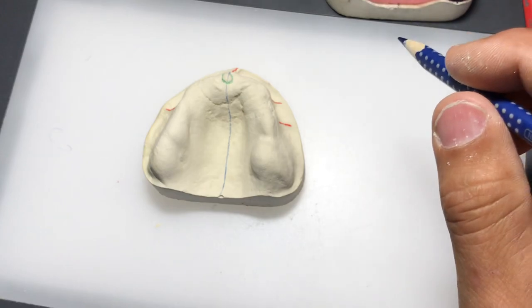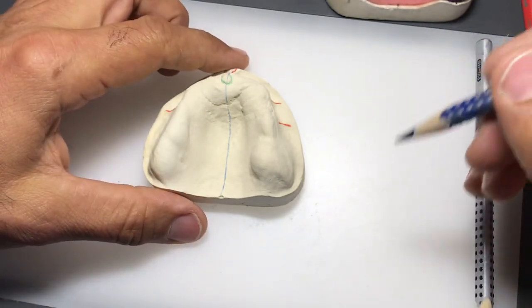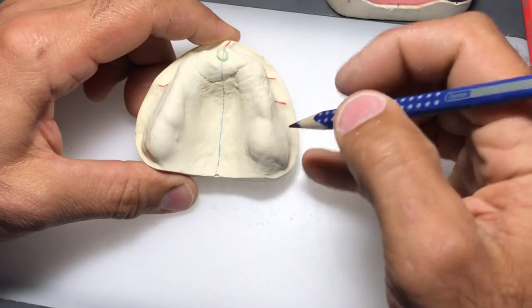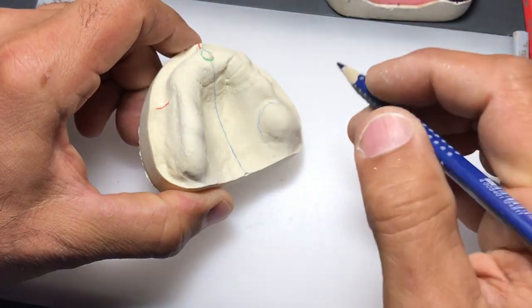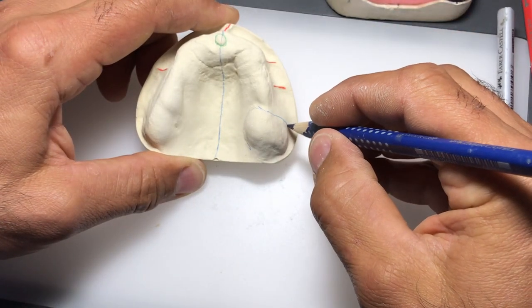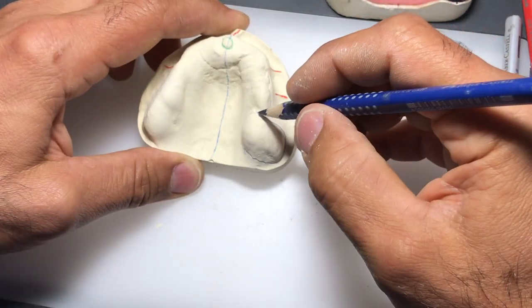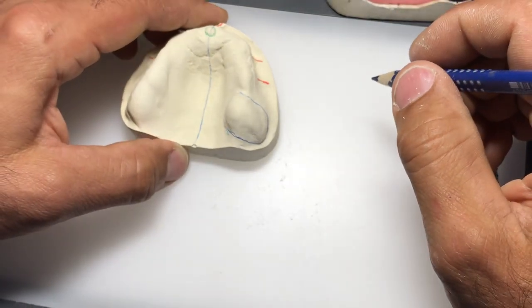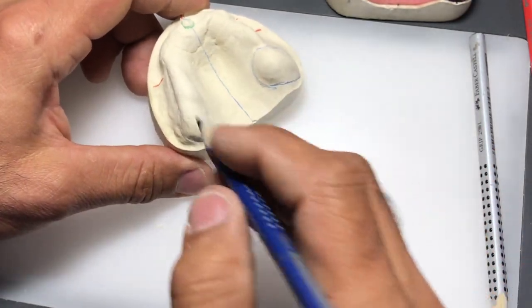Another very important landmark to identify - because it needs to be covered by the custom tray and eventually reproduced in the final impression - are the maxillary tuberosities. These are areas of primary support for the maxillary denture and usually easily identifiable. Remember we always think from the patient's perspective, so what looks like the right side to us is actually the maxillary left tuberosity from the patient's view.